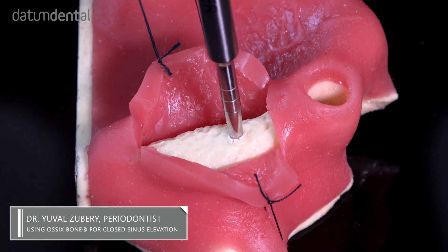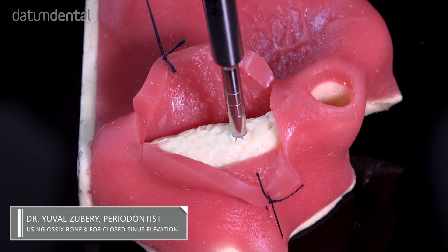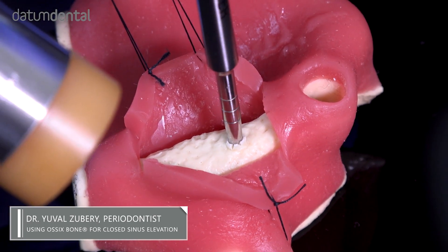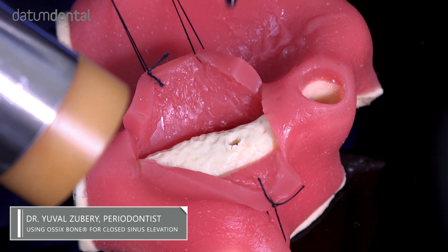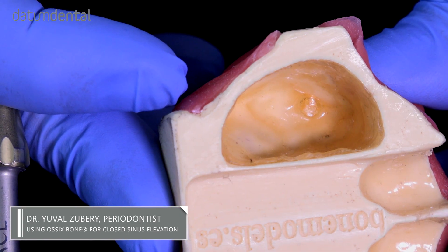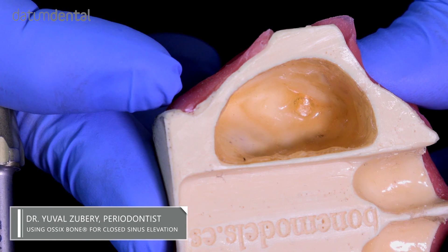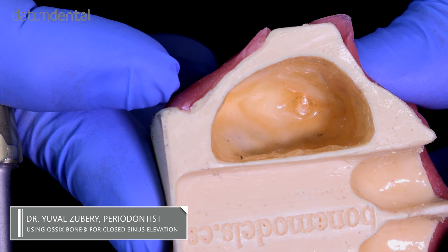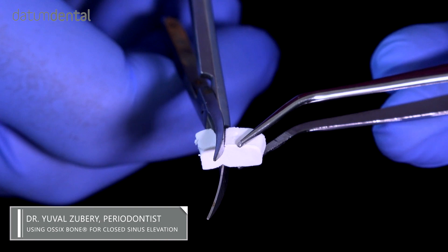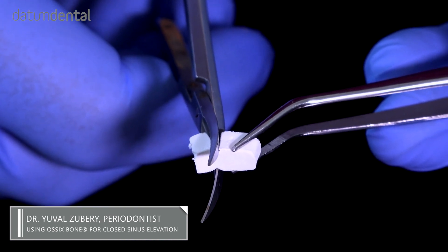Following initial drilling to the sinus floor, an osteotome is used to perforate the cortical plate of the floor of the sinus. You can see the membrane initial elevation with fragments of the cortical bone from the sinus floor.